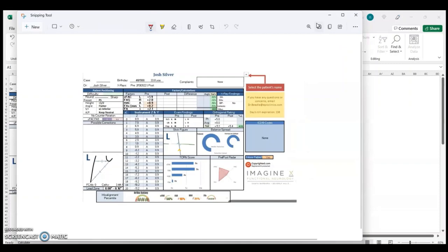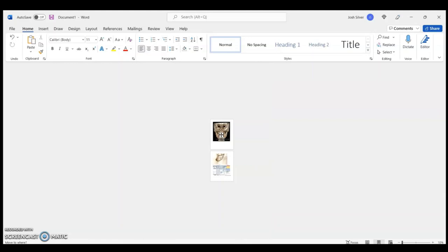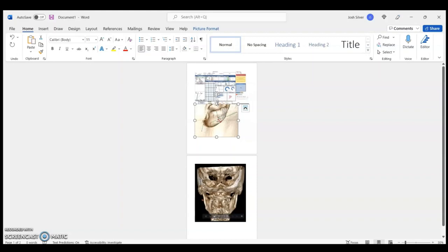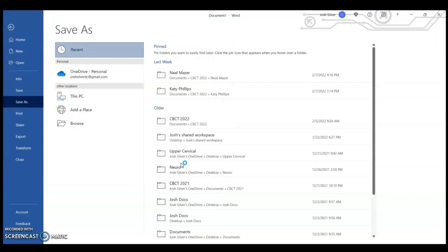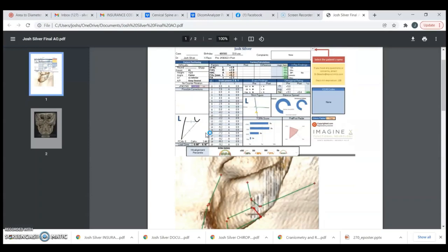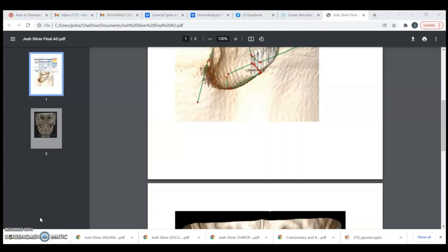I save the listing as 'Josh Silver vectors,' then open Word to drop in the TP image, the posterior image, and the listing card, and save as 'Josh Silver final AO' as a PDF. The complete listing card shows the TP location, all the math I need, and a nice posterior view so I can double-check the contralateral pattern. That's basically how I do it — looks like it took about 30 minutes. Practice makes perfect.